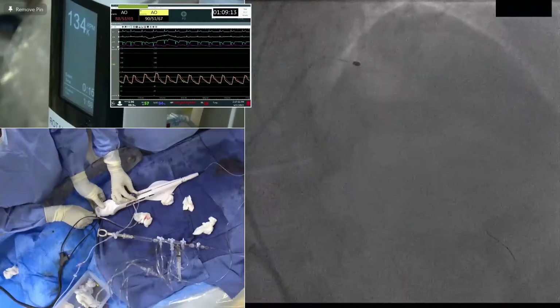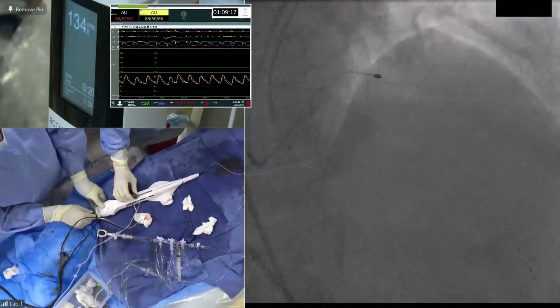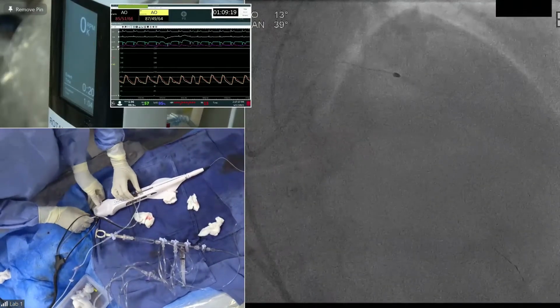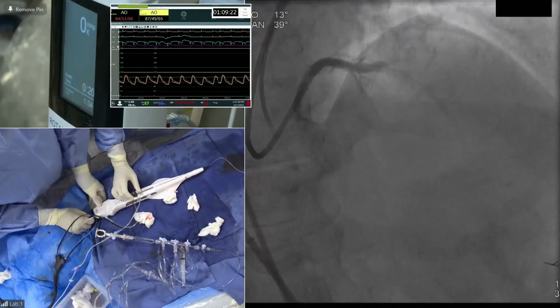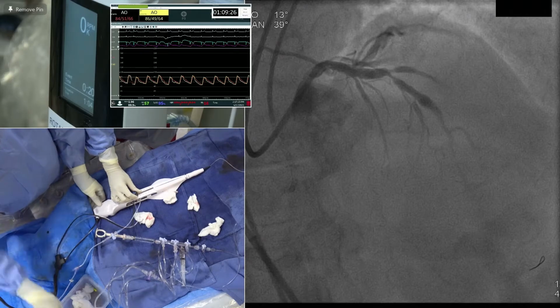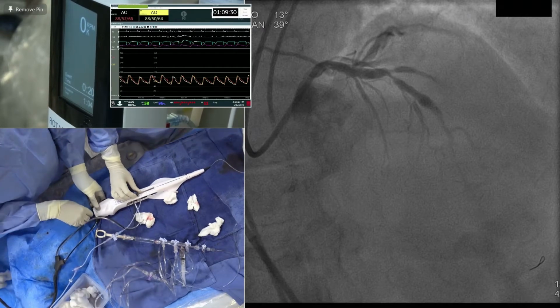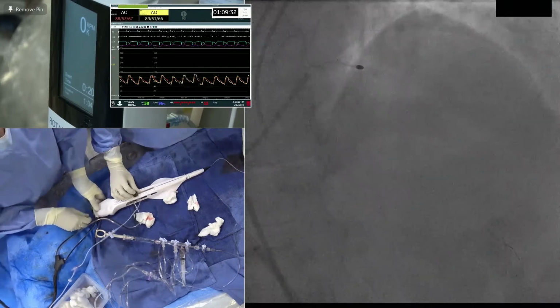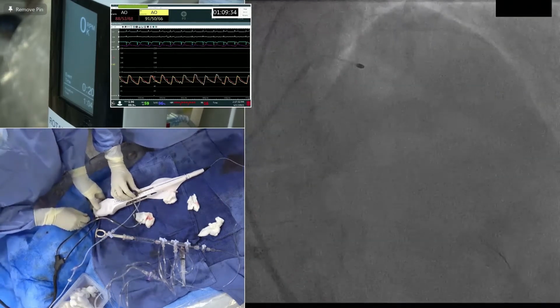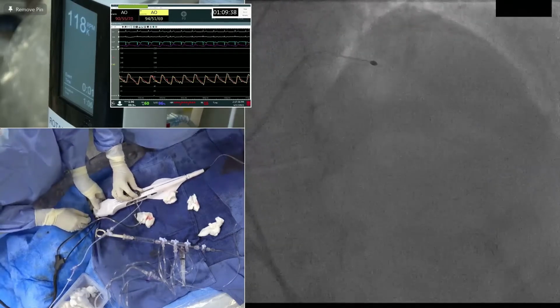George, just to finish out with the surgery backup, we do a lot of Rota. We had surgery backup. So usually we say don't jump more than 0.5, but the goal was 1.25 for the distal, not for the mid. Mid is a short lesion, so going with a 2.0 burr is reasonable because it's a heavily calcified vessel. And that's what we're doing, going through the regular process of slow advancement.